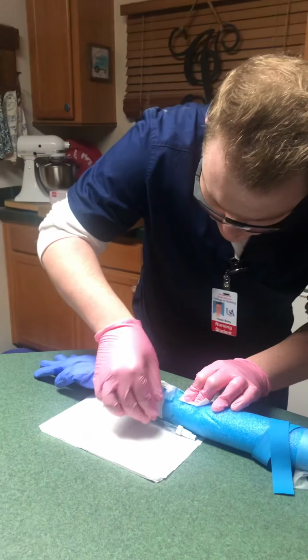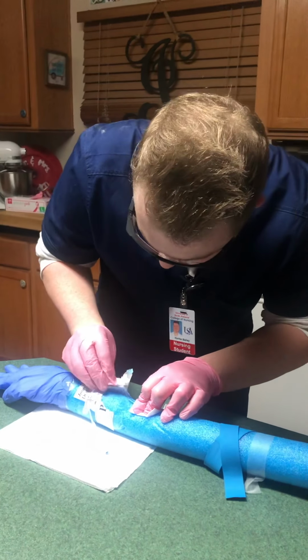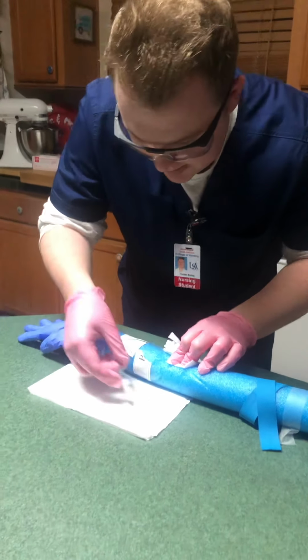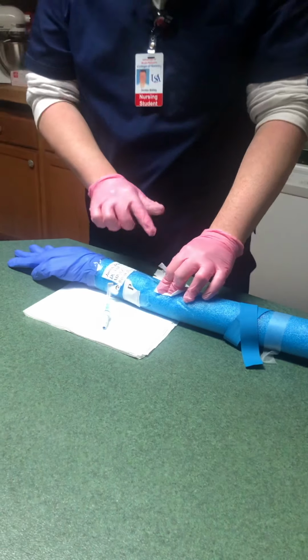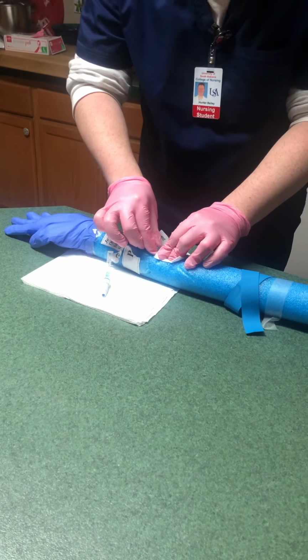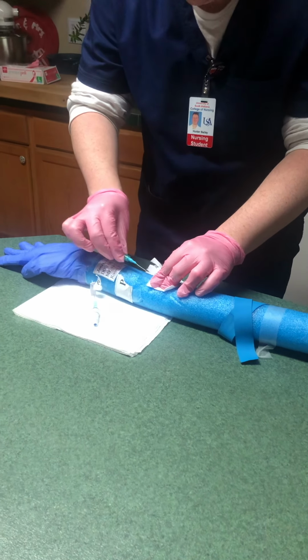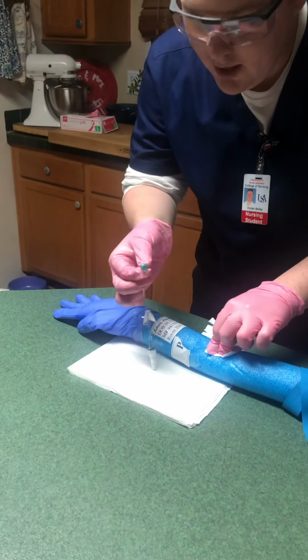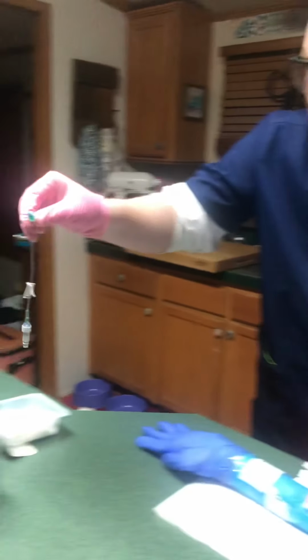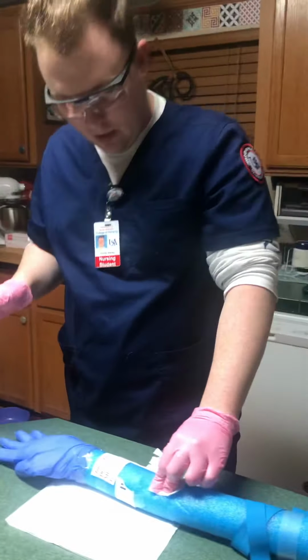Okay, so now I'm taking off the tape, and it's ripping my paper, but it's okay. Okay, so now that I have the tape taken off, I'm still going to hold pressure right here, and I'm going to keep the catheter parallel to the arm, and I'm going to slide it out slowly. Okay, and hold pressure. Now I'm going to look at the intactness of the catheter's tip and make note of it and dispose of it into the sharps container.